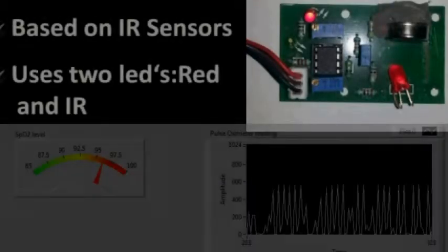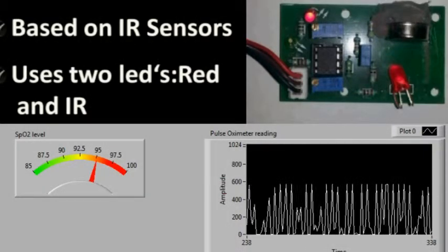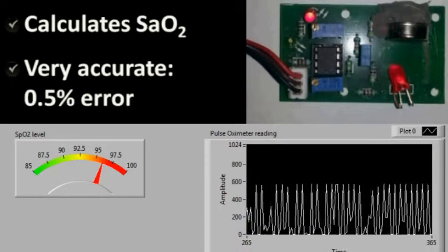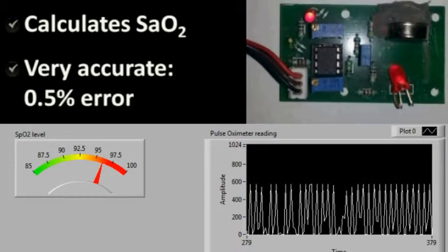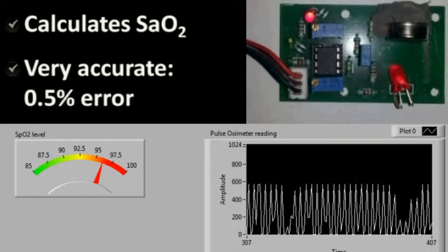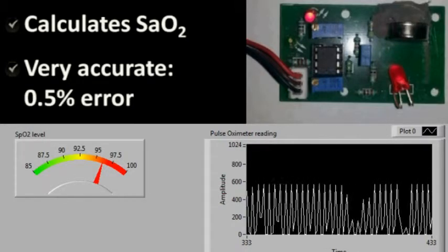The next component we'll be talking about is the pulse oximeter. The oximeter measures the saturated oxygen content in the blood. It is based on the difference in the absorption of red and IR light by the human tissue. Saturated oxygen content in the blood is calculated by interpolation of the ratio of the IR and red light. The SpO2 levels are displayed on the front panel using the SpO2 level meter as shown below.